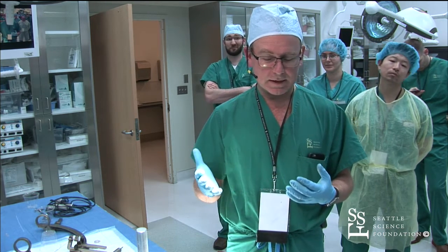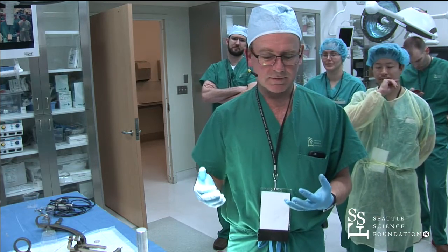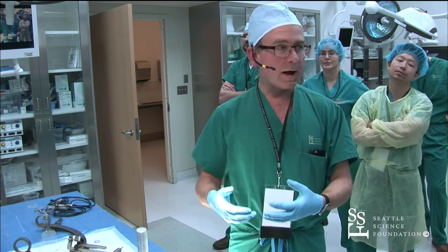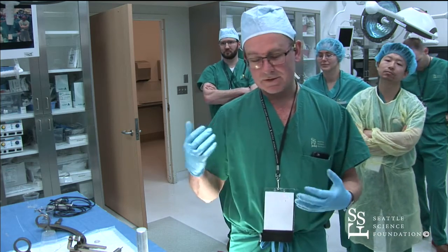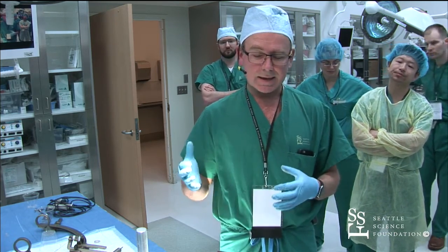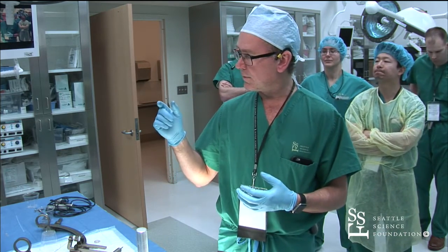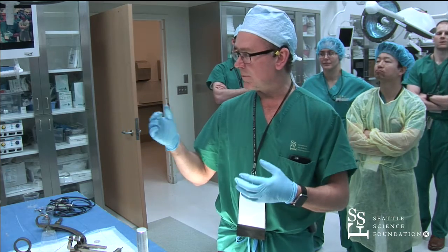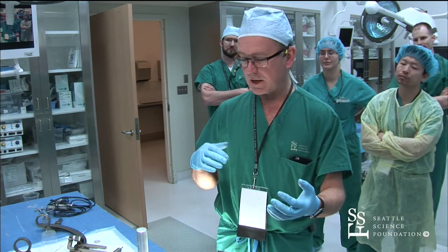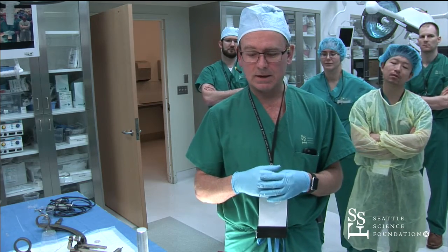But if you think from the study, it's been about, I think, a 2.5% risk of infection per operation for that patient. So obviously the more you have to do, the more you're exposing them to over time. And I think they've looked, and the risk of the 5th change is not worse than the risk of the 2nd change, but any change that you have to do is not ideal.